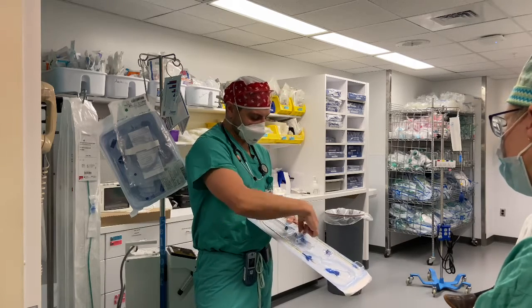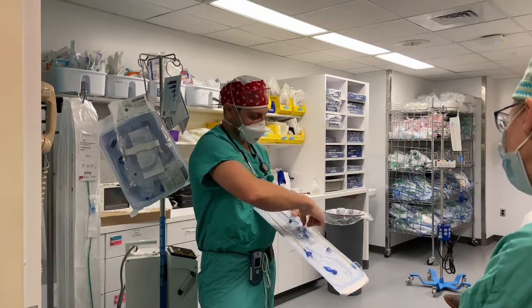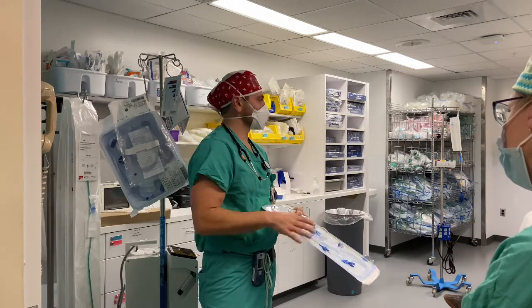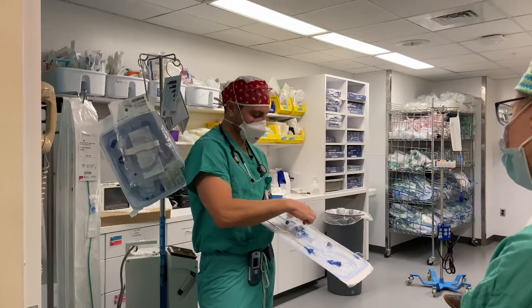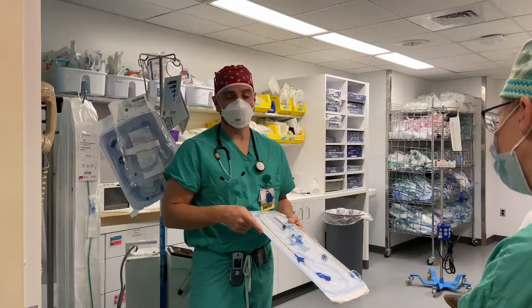And the reason it's got this little connector that you can tighten down is so that once you've got the balloon where you want it to be, you crank this down and then it won't move. Okay? So it's designed to be loosened up while you're placing it, and then cranked down so that it doesn't move once it's where you want it.